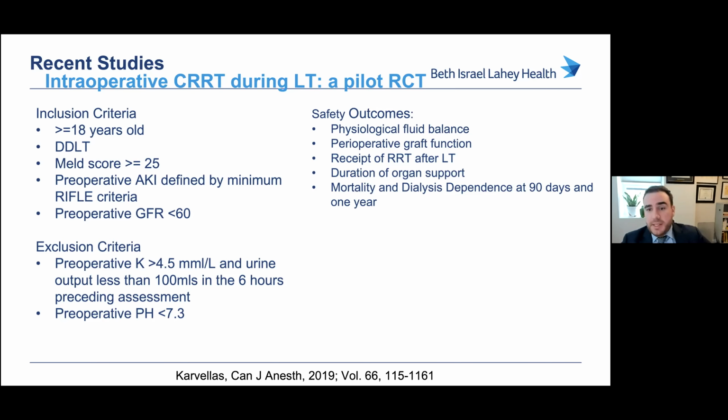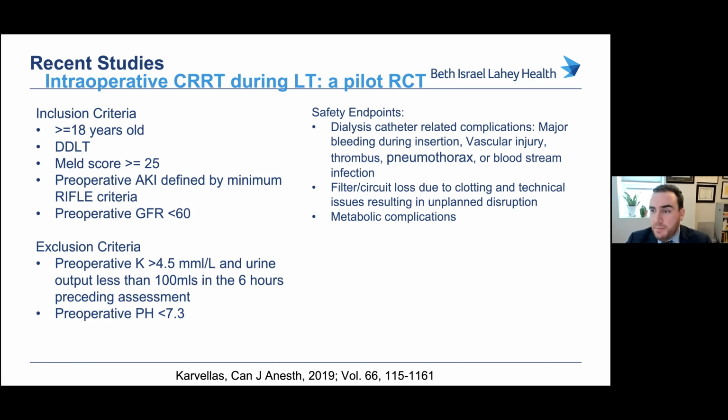They tried to look at several things: fluid balance, graft function, and survival. They also tried to look at safety endpoints related to complications from the insertion of the lines, and resource issues like filter and circuit loss.